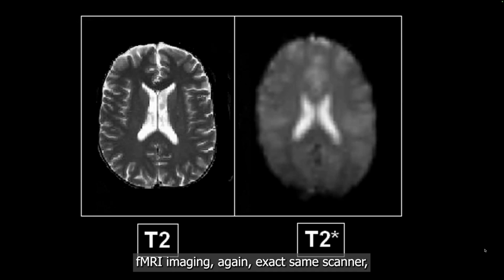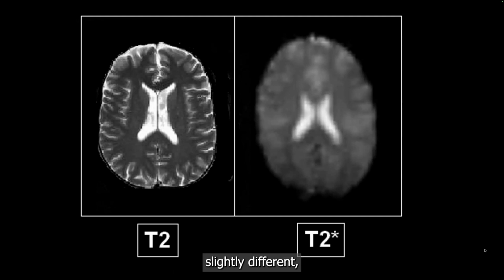Again, the exact same scanner. You could run this scan and then stop the scanner. You have this picture, and now set up the sequence slightly differently. And now you have T2 star, and these are BOLD data.